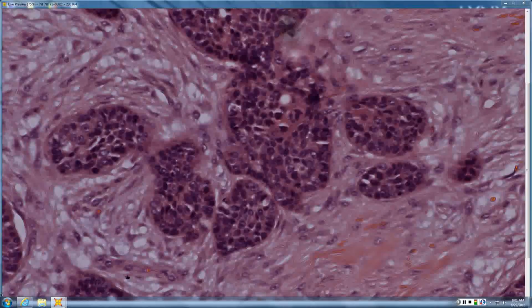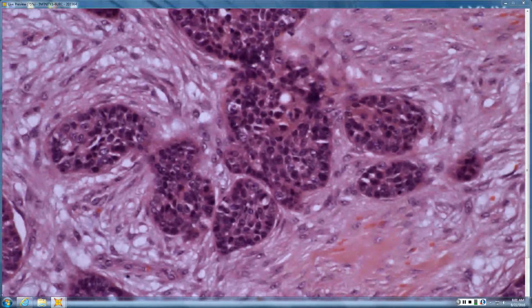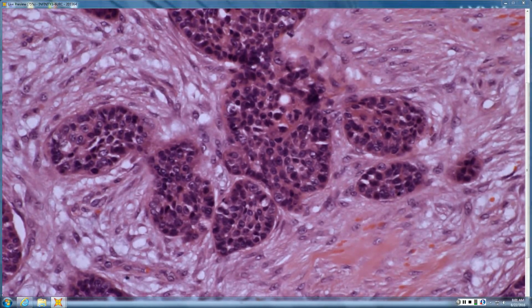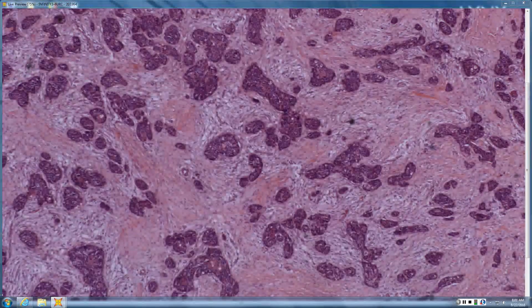And when you look at the islands a little closer, do they have a normal nuclear cytoplasmic ratio like normal glandular tissue, or do they have a high nuclear cytoplasmic ratio, nuclear molding, hyperchromasia, pleomorphism, and mitoses? All of those. So it would be the second choice. And so do you think this is malignant or benign? Malignant. And so this could be a malignant mixed tumor. Could be, certainly some kind of sweat duct adnexal malignant tumor. So malignant acrospiroma, malignant mixed tumor. Doesn't matter that much because the behavior is going to be the same. They both have potential for metastasis. They're going to be locally aggressive.